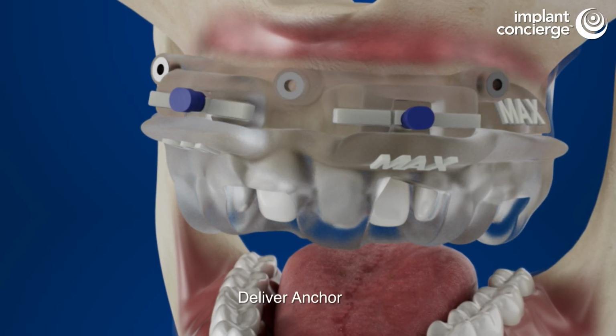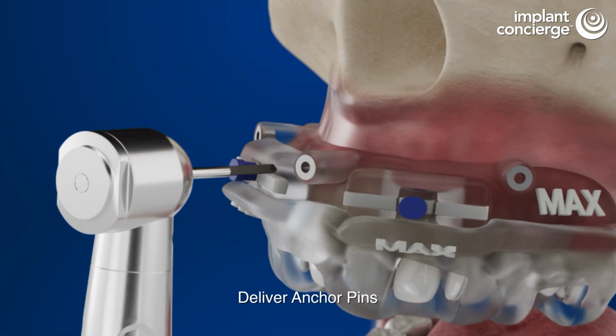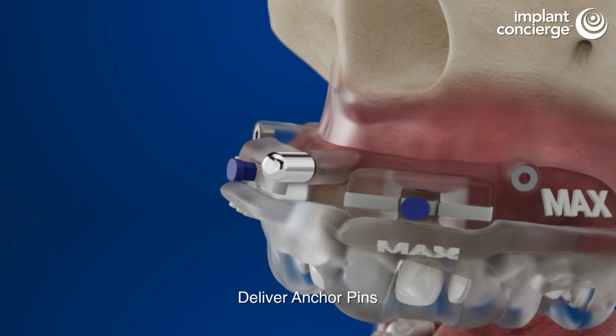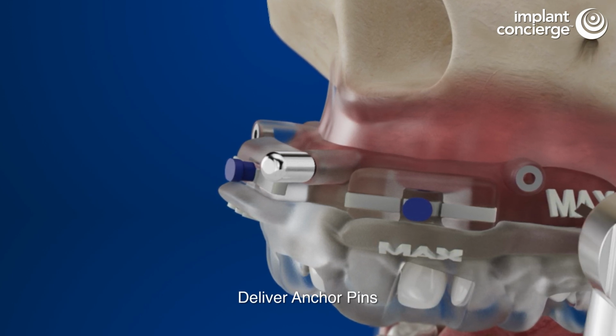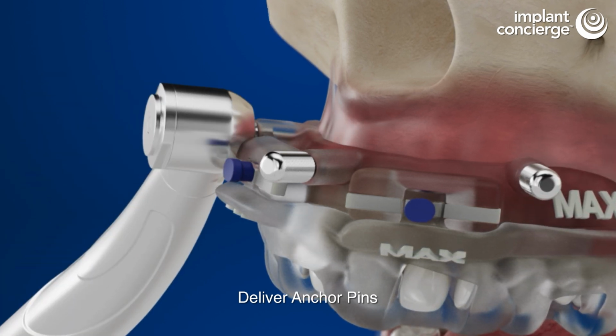Keep constant apical pressure on the guides while drilling the anchor pin osteotomies sequentially. Starting with the anchor pin closest to the midline, insert each anchor pin until reaching the desired depth and repeat the process, alternating sides for optimal precision.